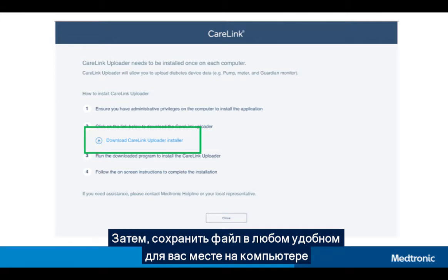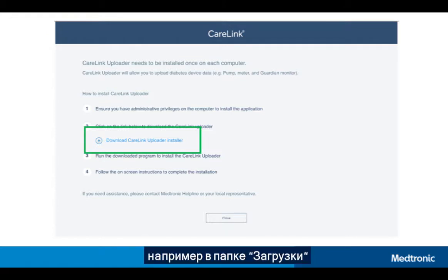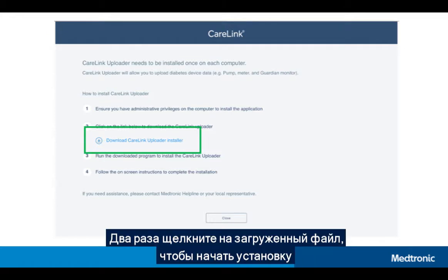After you have signed in, click on the Download CareLink Uploader Installer link to save the file onto your computer. Save to a folder that you can easily find, like the Downloads folder. Double-click on the downloaded file to start the installation.